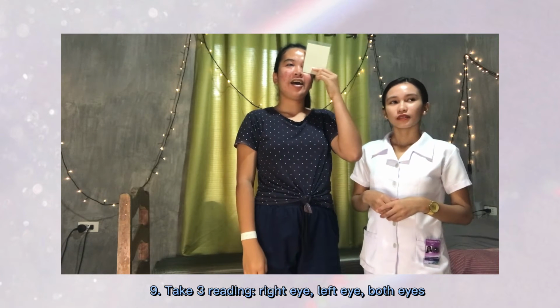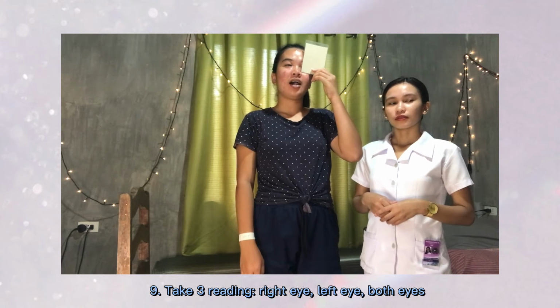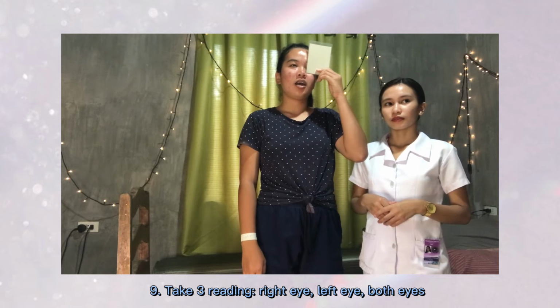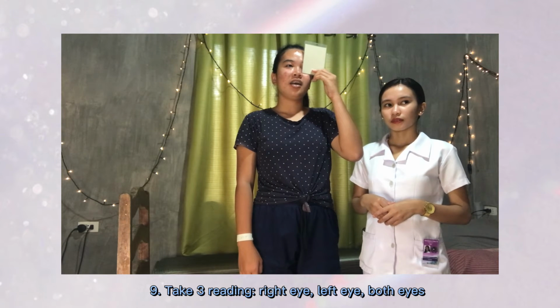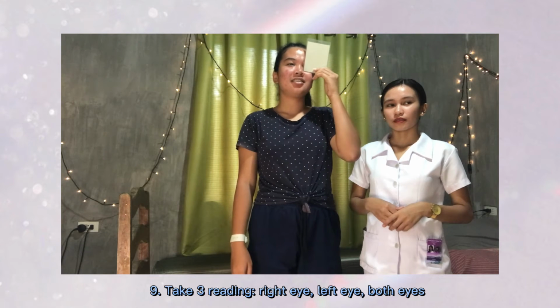E F P T O Z L P E G P E C F D E D F C Z P F E L O P Z D D E F P O T E C.